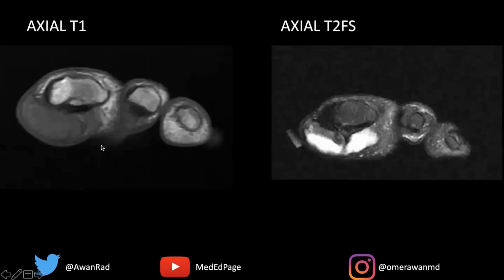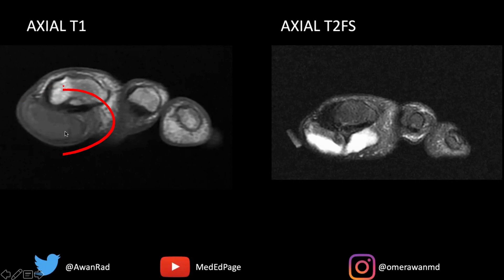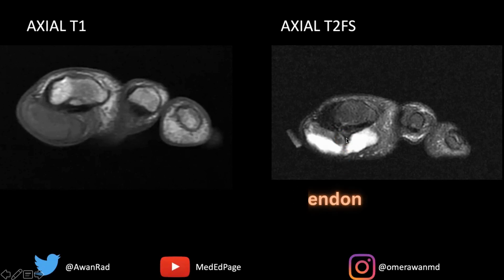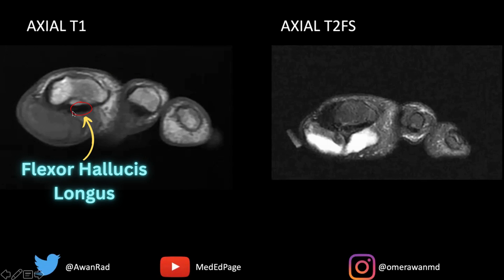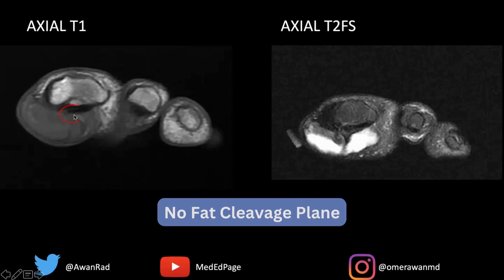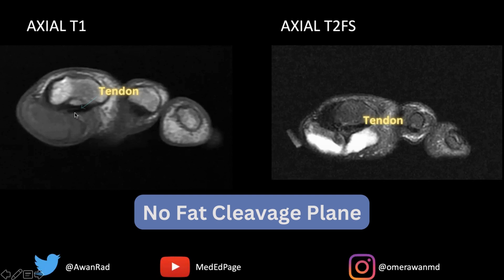Coming back to these images, notice that there's a lesion here along the plantar aspect of the great toe. It's T1 hypointense, or darker than muscle, and T2 predominantly bright — heterogeneously hyperintense to muscle — but there are some areas of dark, hypointense signal. Notice that it's intimately associated with this tendon. This black oval structure is the flexor hallucis longus tendon, and there's no fat cleavage plane between this tendon and the lesion on either T1 or T2 weighted images.